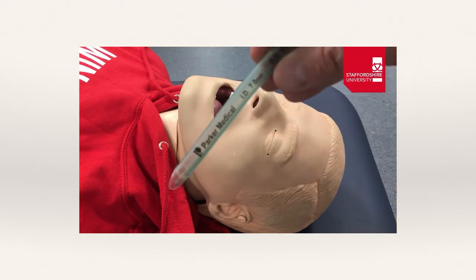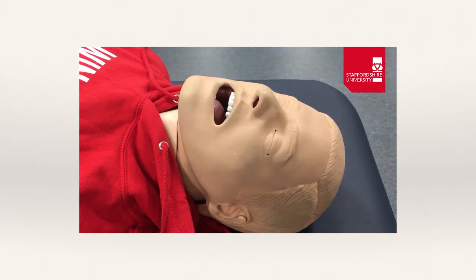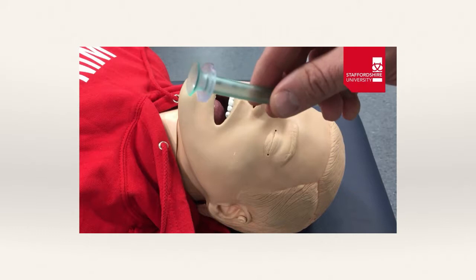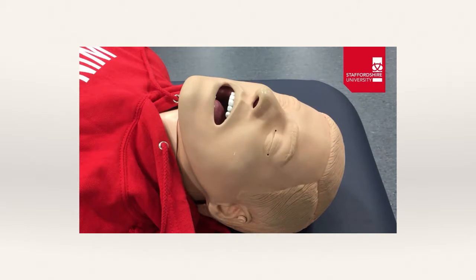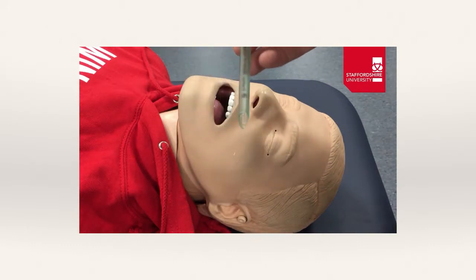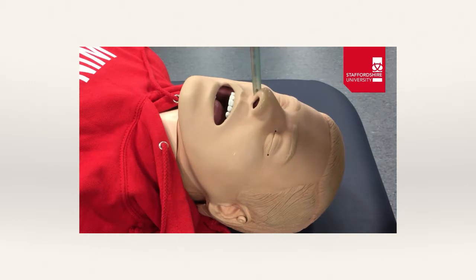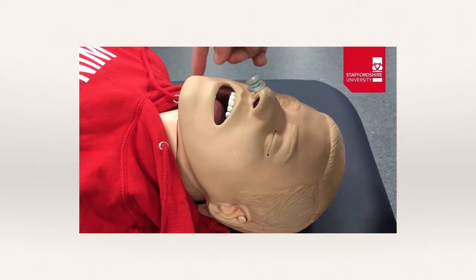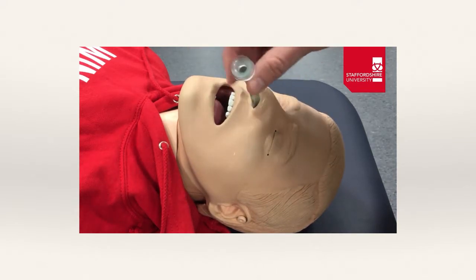When applying lubricant, be aware that you don't want it to go past the open end of the airway so you're not obscuring it. This airway comes with a washer on the end to prevent it from going too far into the patient's nostrils. Some airways also have a safety pin to clip into the airway itself. We're going to insert the NPA with the bevel facing towards the patient's septum, pushing it vertically down into the airway and allowing it to follow the anatomical curve to end up at the bottom of the nasopharynx.